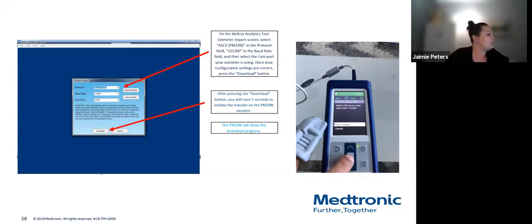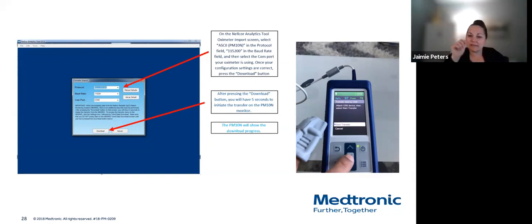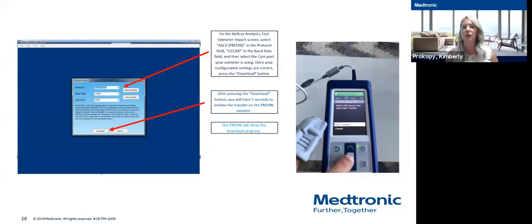It says, with the newer computer oximeters, we have to wait until the test is completed and download to see the results. So if he finds it frustrating that he can't see second by second on the screen, is there a way to, I think you can see the clock, can't you? Yeah, you can. At the top, it has the clock, and then you can go through your history and look at your continuous data. But I understand it's frustrating not being able to get that full report.